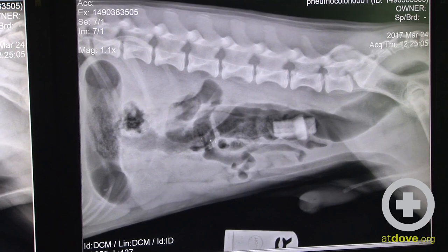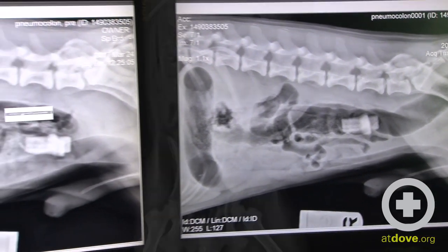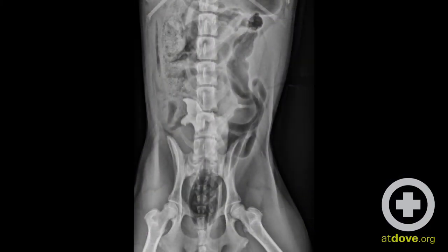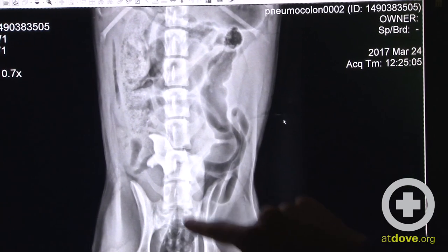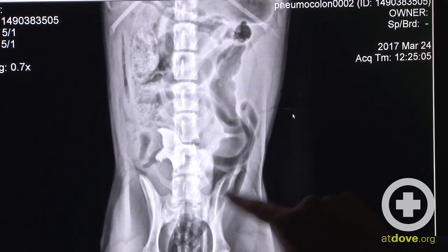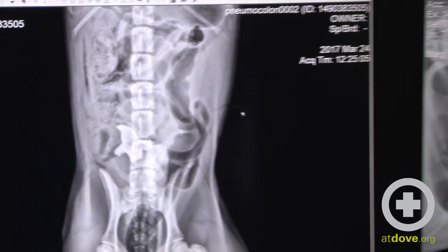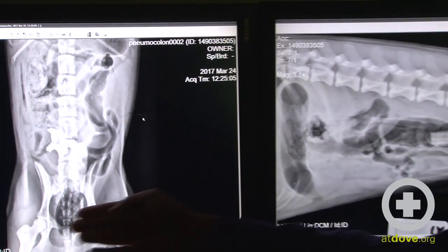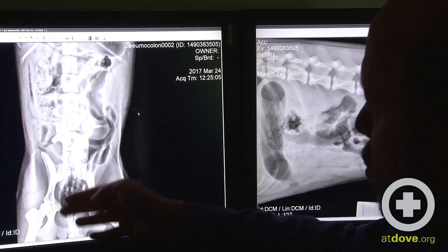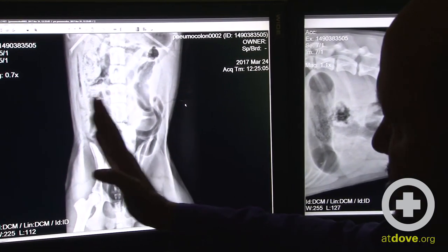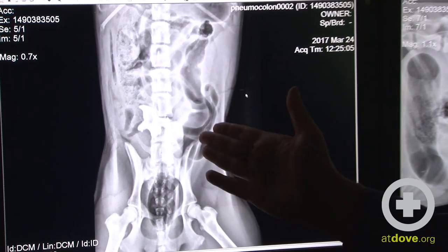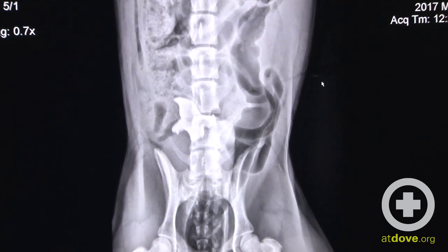When we look at the ventrodorsal view taken after instilling gas into the colon, we can see the outline of the colon on the left side very well. This structure does not look like it's within the colon on both views. On the lateral view it looks like it is within the colon, but on the ventrodorsal projection we can see the colon go up on the left side, and this structure is more right-sided — and therefore likely within the small intestine.